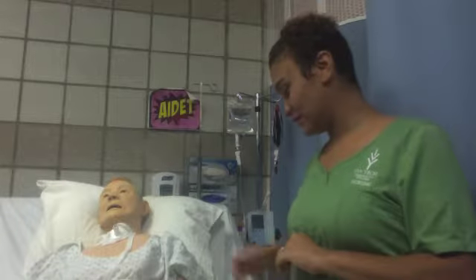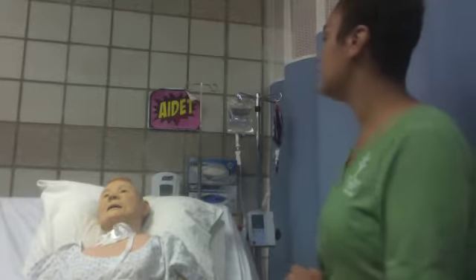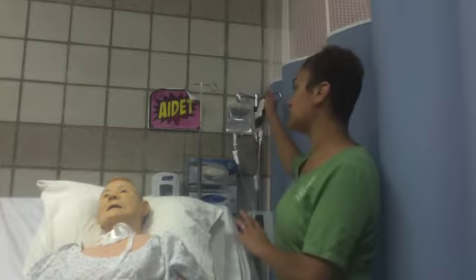Okay, so we're going to go ahead and flow. We're flowing. I'm checking often, coming back, checking for all the symptoms. Once the bag is done, I'm going to verify the vitals at the end as well. Get in-set vitals, compare them to my baseline vitals, compare them to the vitals previously had, make sure that there are no inconsistencies.